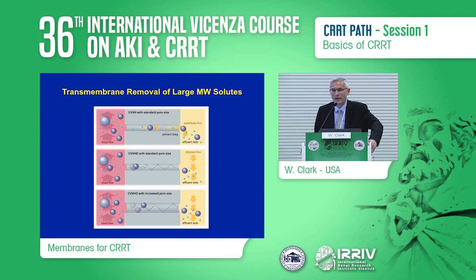Another approach consists of a more traditional transmembrane removal, but kind of, if you will, tweaking the process a little bit. So the standard technique of CVVH can be used using a relatively standard pore size filter, and that means driving more solute across the filter by using relatively high ultrafiltration and replacement fluid rates.